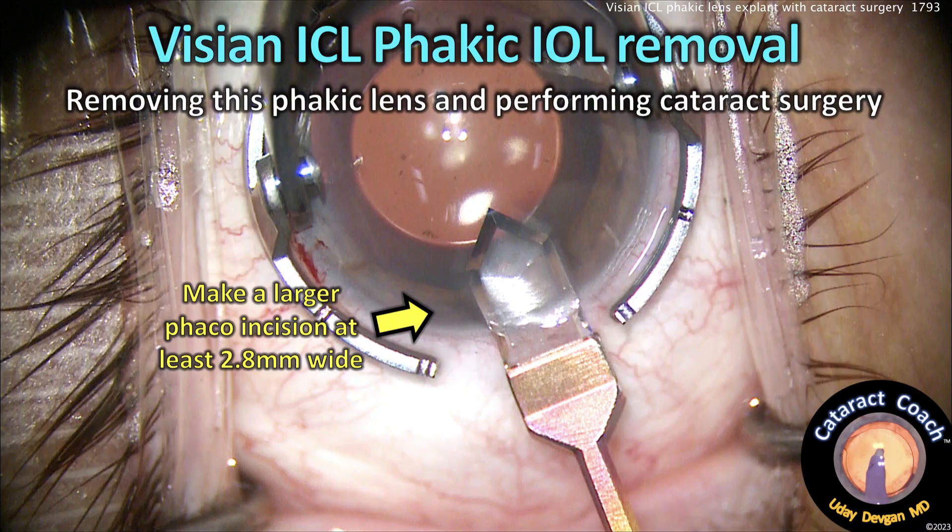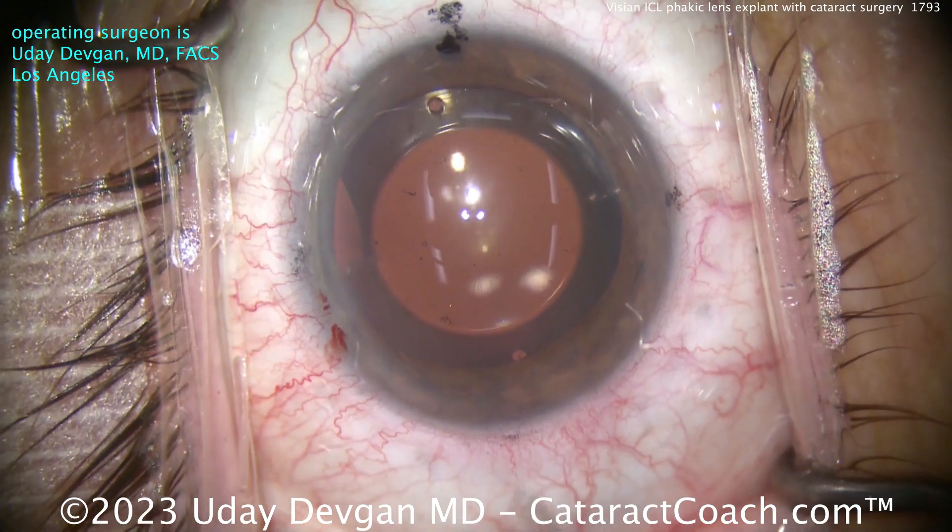First things first: make a big incision. You need a 2.8 millimeter wide incision in order to remove this lens comfortably. Don't make a 2.2 millimeter incision.